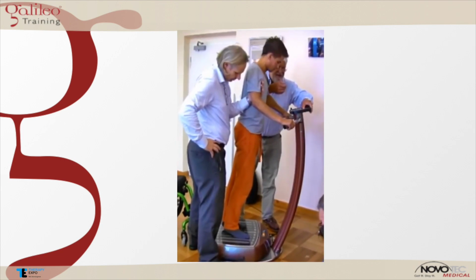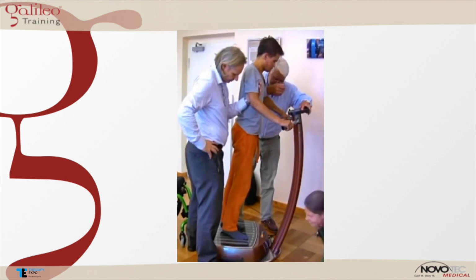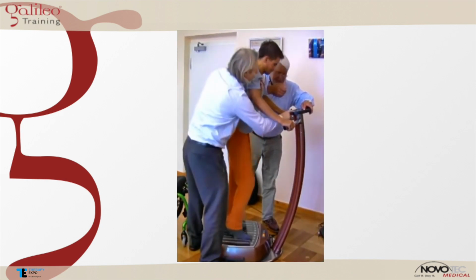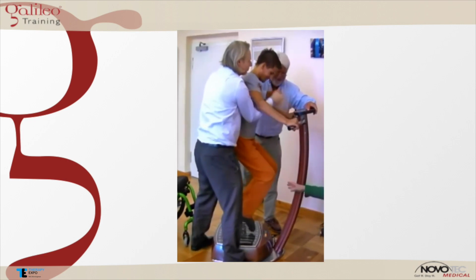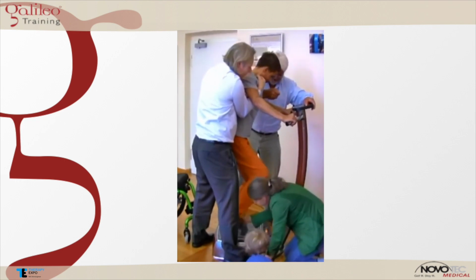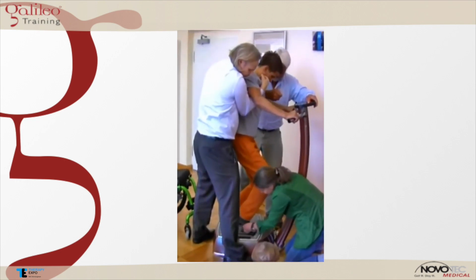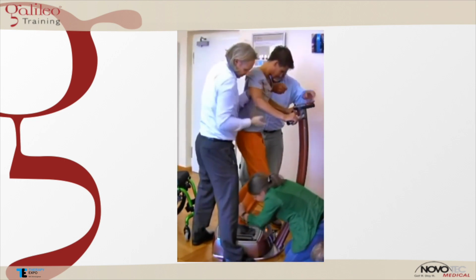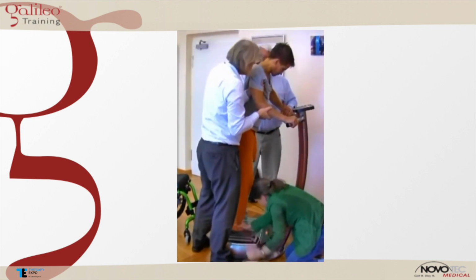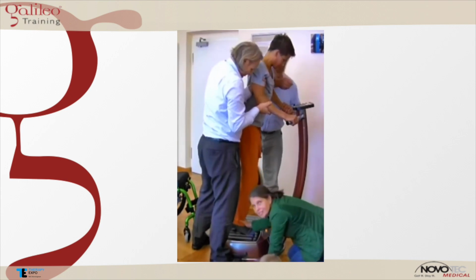So now the machine stops, and in the moment the machine stops, he collapses. Now we restart the machine. The mother is bringing the foot in contact again with the platform. And when we induce these stretch reflexes again, then he can straighten up again. And this is now June 2012.